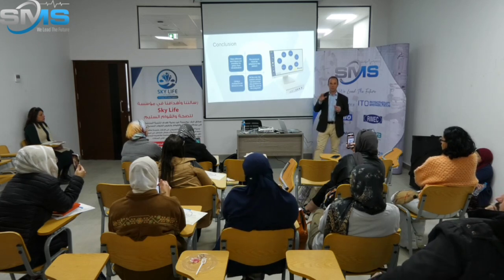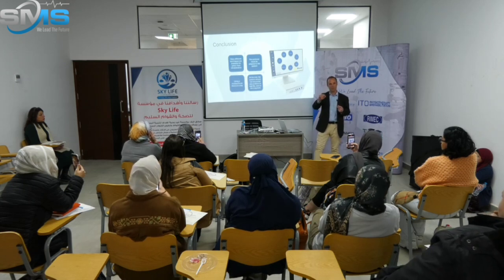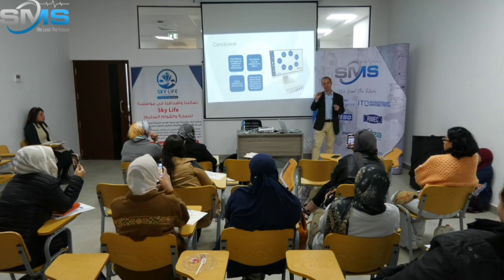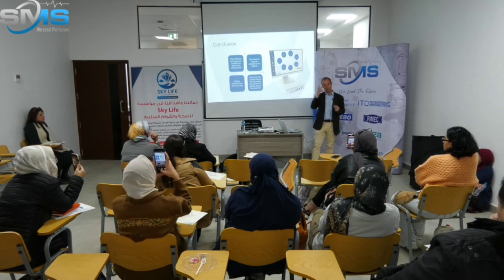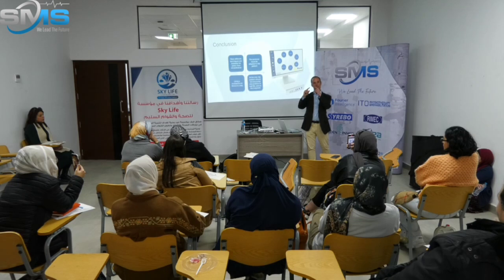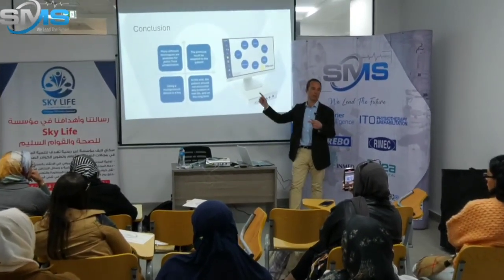Because, for example, if your patient starts to lose continence, if she has done biofeedback correctly, she will know what to do at home to do some squeezing exercises and so on to get it back correctly. Whereas if you use stimulation, she's lost, she has to come back to you.